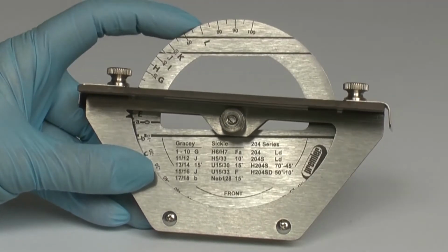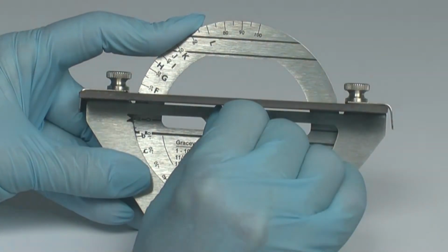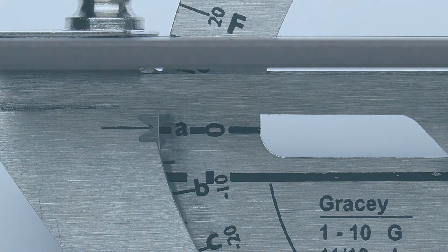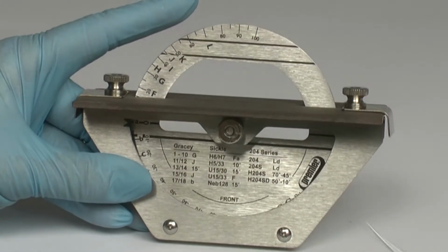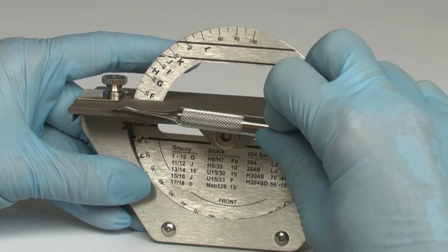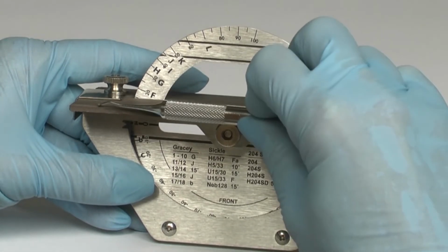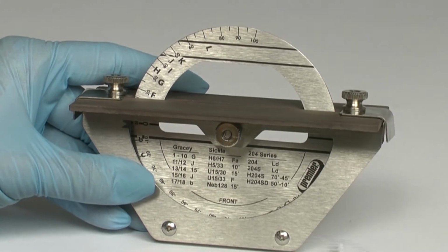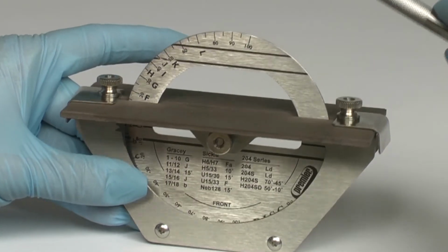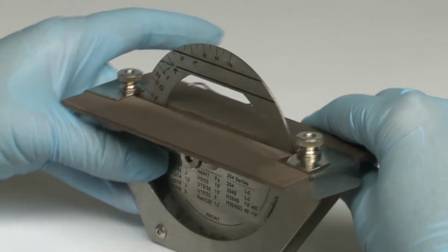To sharpen the alternate edges, change the setting on the disc sharpener to 0 degrees. Position the toe facing the wheel. Notice the handle is now below the stone and aligned with the reference lines on the wheel. When in this position, it is easier to hold the instrument in your palm. Move the blade across the stone. Flip the instrument to the rear stone with the tip pointed towards the wheel and handle aligned with the bold reference lines. Repeat the same sharpening step.